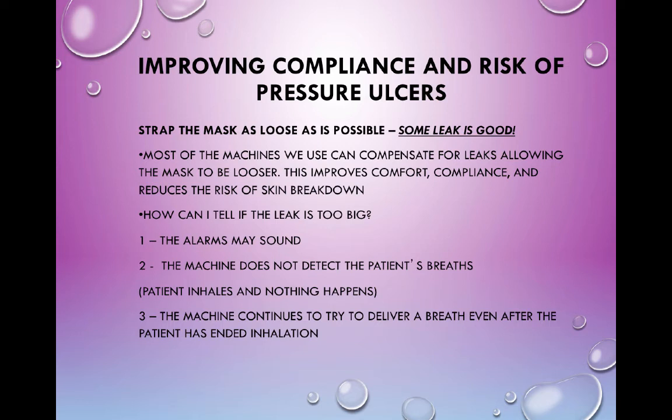We actually want them to leak now. So we'll hear all the time, oh my God, the mask is leaking. That's good. We want it to leak. We actually want leaks to a point. So if it's leaking a little bit, we like that because it means it's loose, especially that patient that's going to be on 3 days straight, and we're going to try to give them as many breaks as possible.